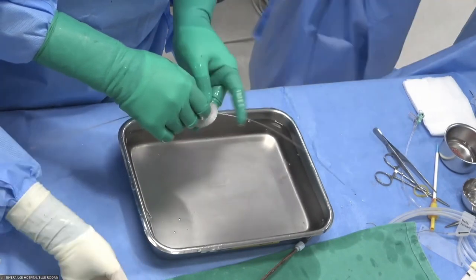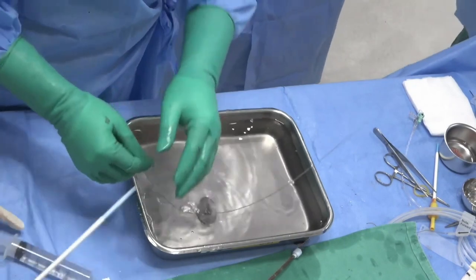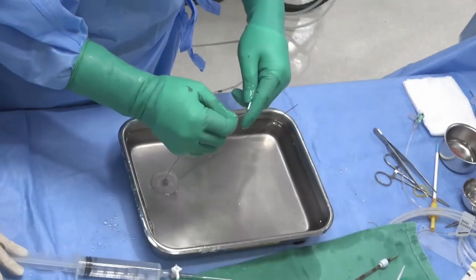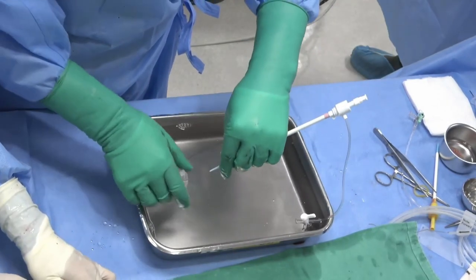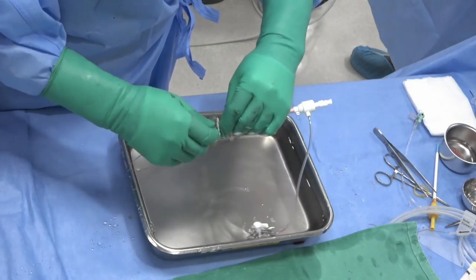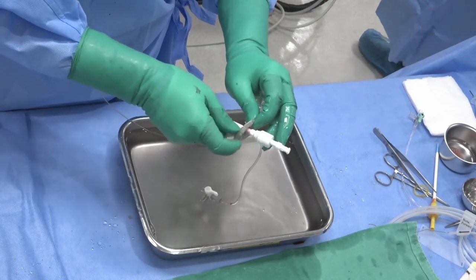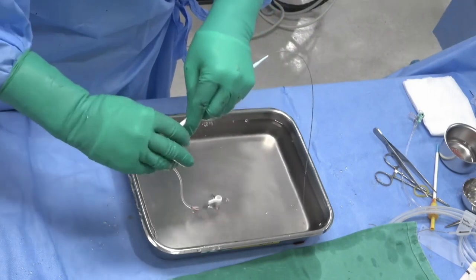However, I think I used the proper technique to locate the device in the right place. So I think that the balloon-assisted technique and redeployment may not make any difference.